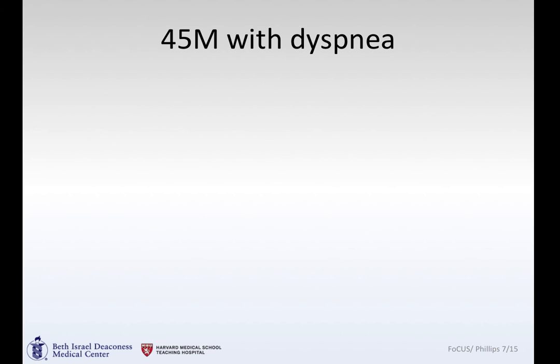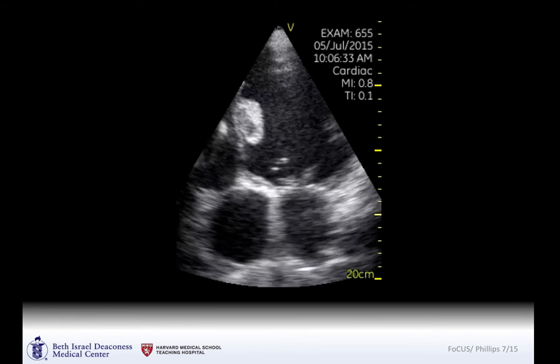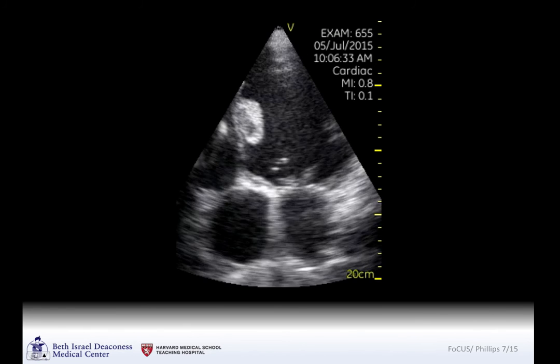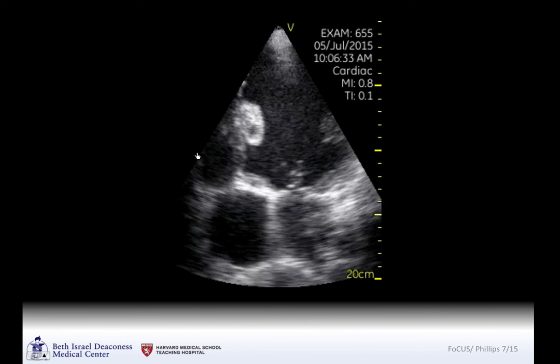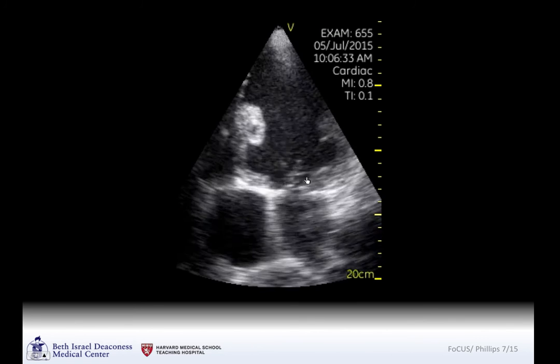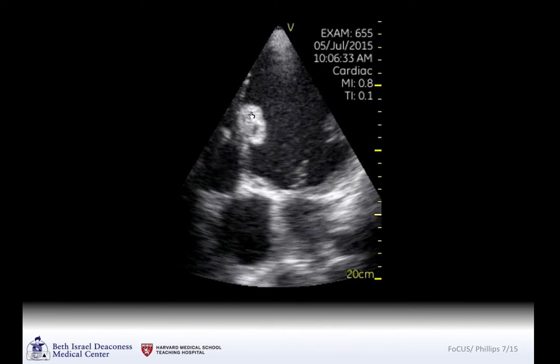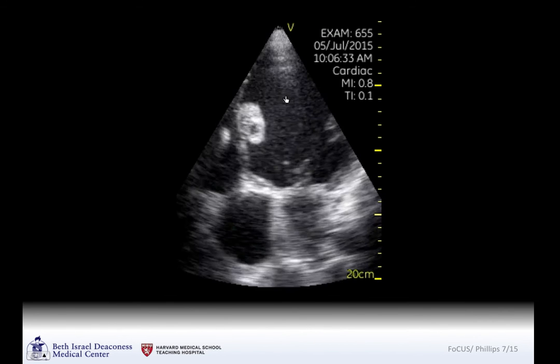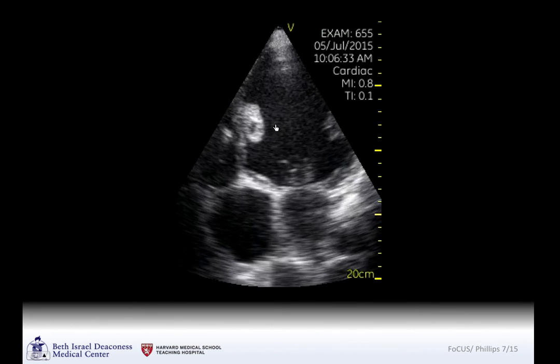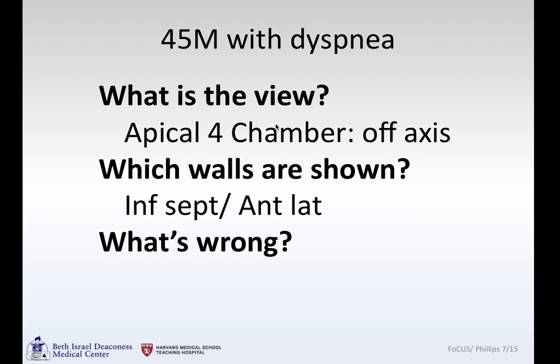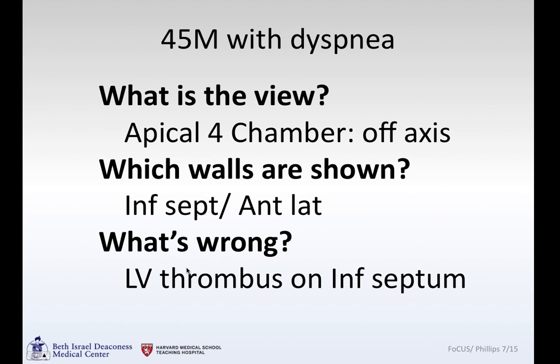A 45-year-old gentleman presenting with shortness of breath. Apical four-chamber view: left ventricle, right ventricle, right atrium, left atrium. A little off-axis — we're not getting the mitral valve like we should — but it's off-axis to help show this large inferior septal thrombus. You can also appreciate the ejection fraction is depressed. The view is apical four-chamber, a little off-axis; walls shown are inferior septum and anterior lateral wall — inferior septum confirmed because the aortic valve is not present. Finding: LV thrombus on the inferior septum.